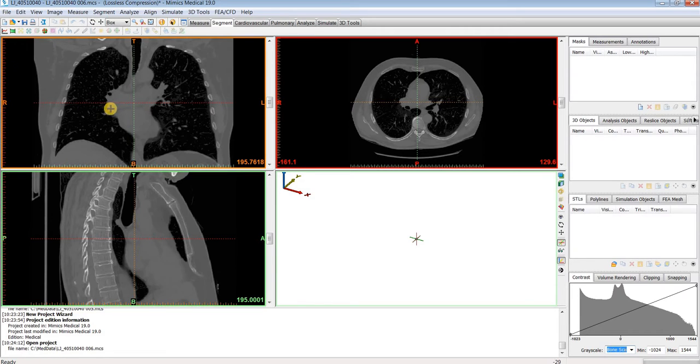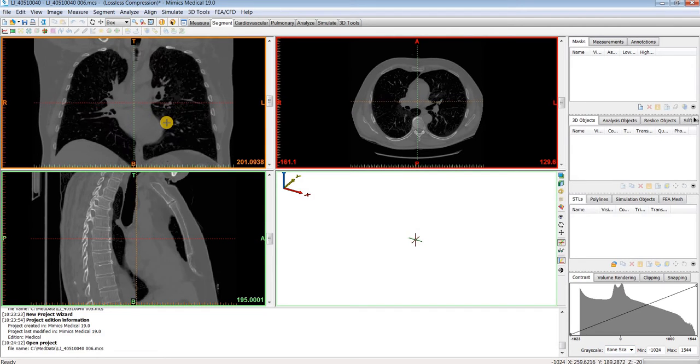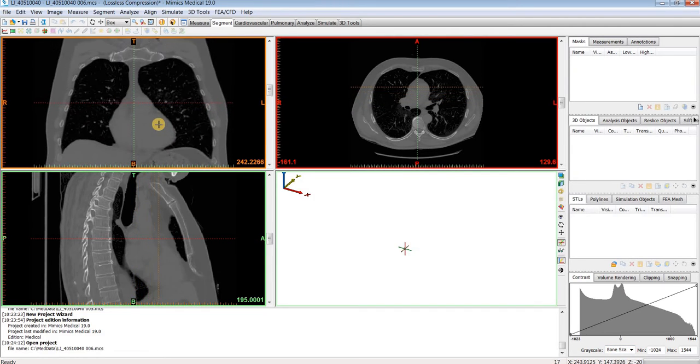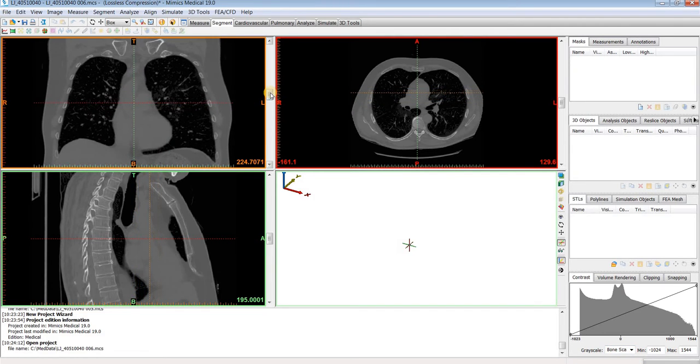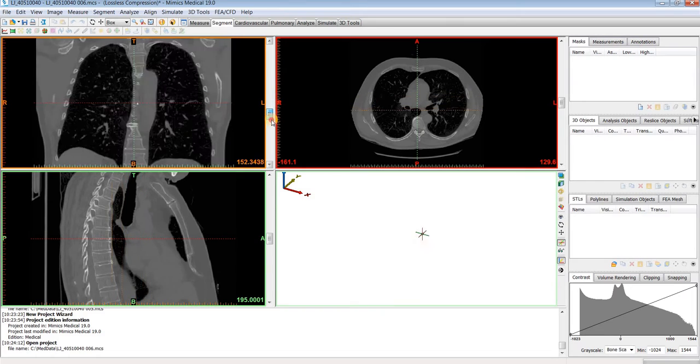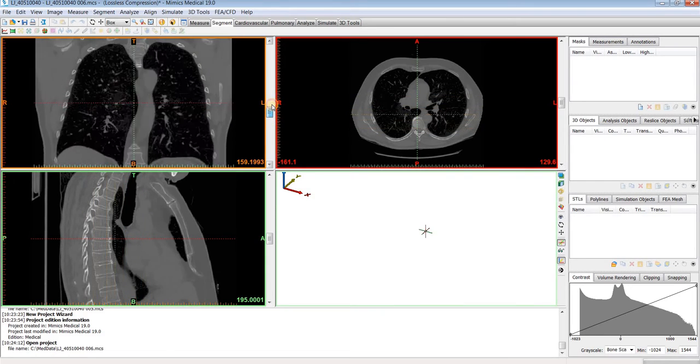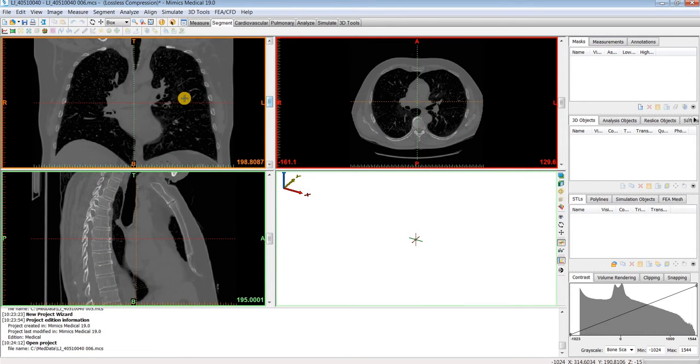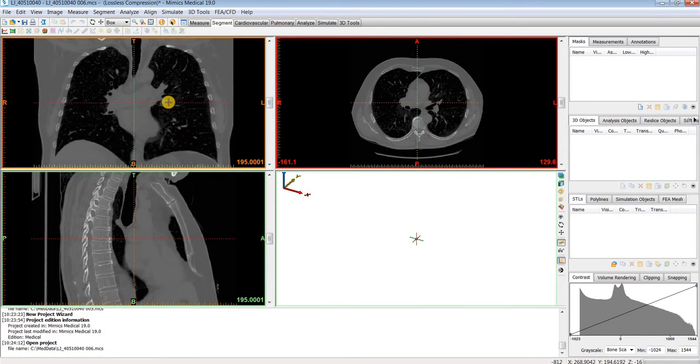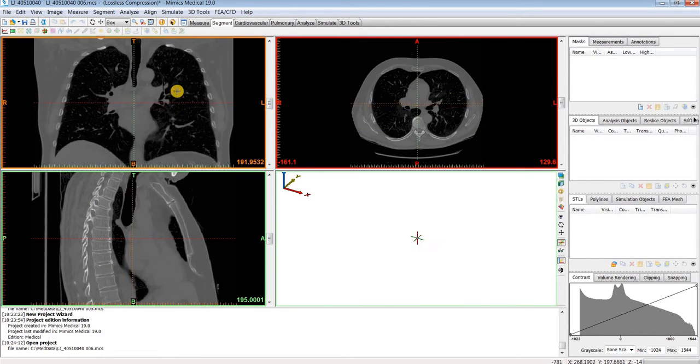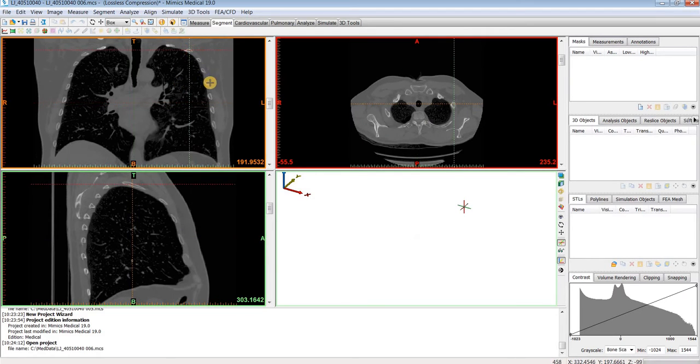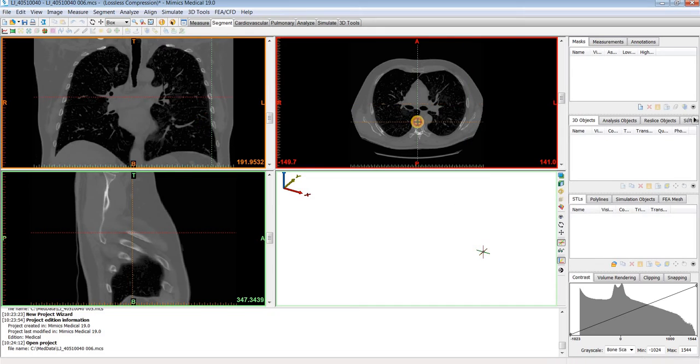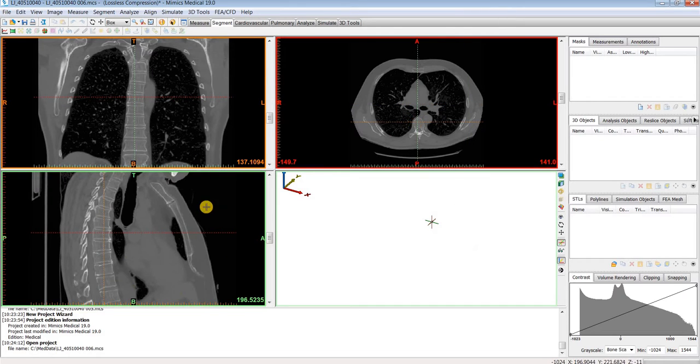To navigate through your images, we can scroll through the images using the scroll wheel on your mouse if you have one, or you can also drag this slider on the right. To navigate, you can also left click anywhere on your images and that will update your crosshairs and the two other planes to that location.